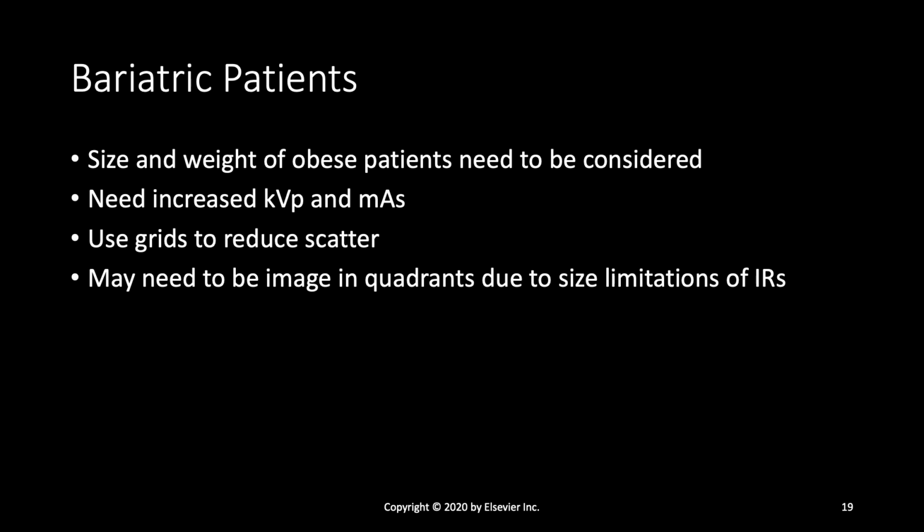And you'll take all 4 images for the doctor to see, because that's how large their abdomen is. And we want to make sure that we get all the anatomy in there. And then before you send it through PACS to the radiologist, label the films like 104, 204, 304, 404. That way they know that there are quadrants for one exam.